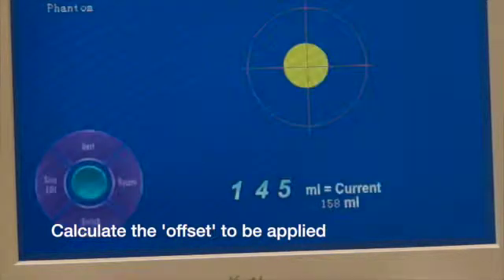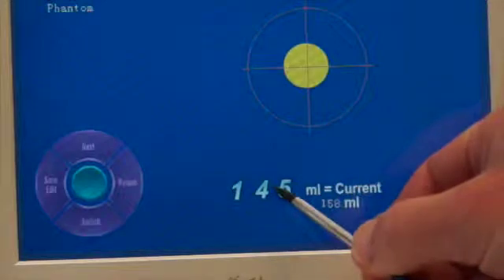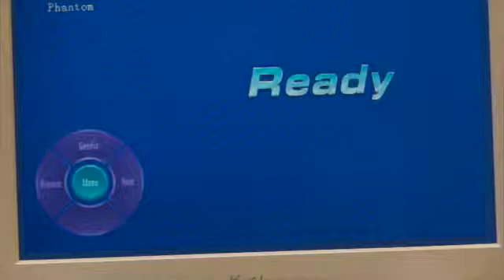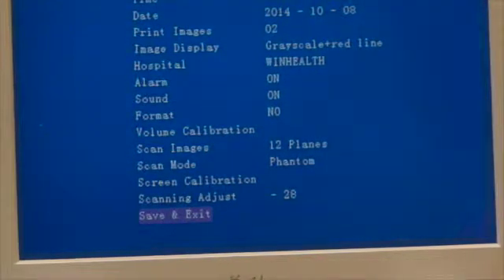In this particular case, the average is 146 mils, so the difference between 146 and 160 is 14, and that is the offset that we need to apply.